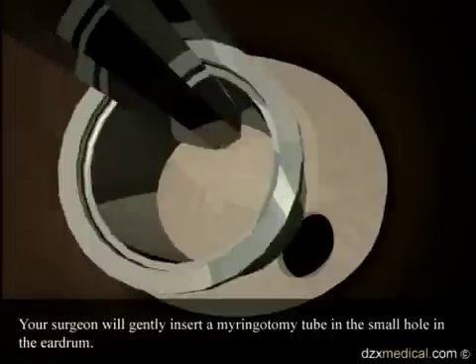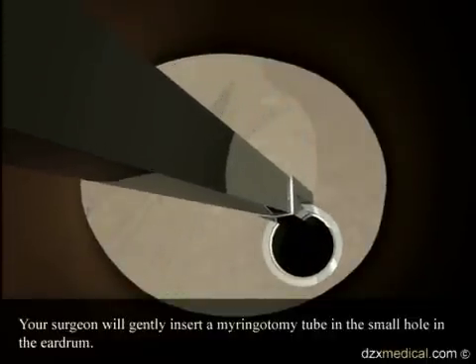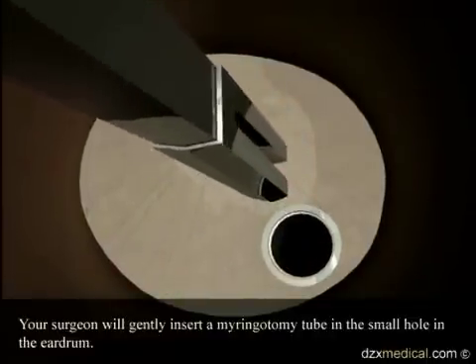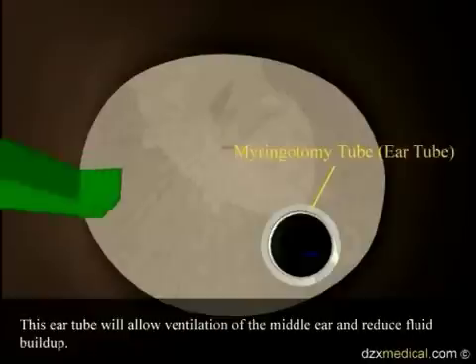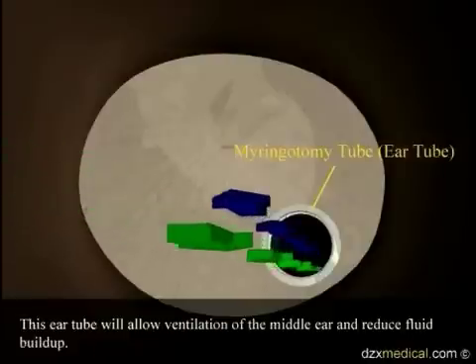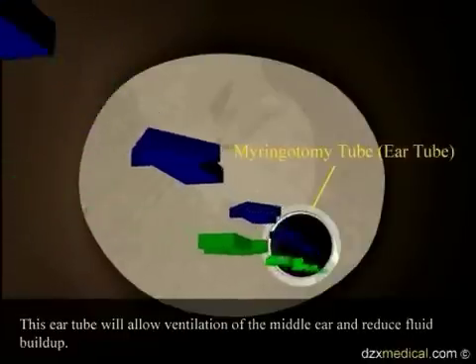Your surgeon will gently insert a myringotomy tube in the small hole in the eardrum. This ear tube will allow ventilation of the middle ear and reduce fluid buildup.